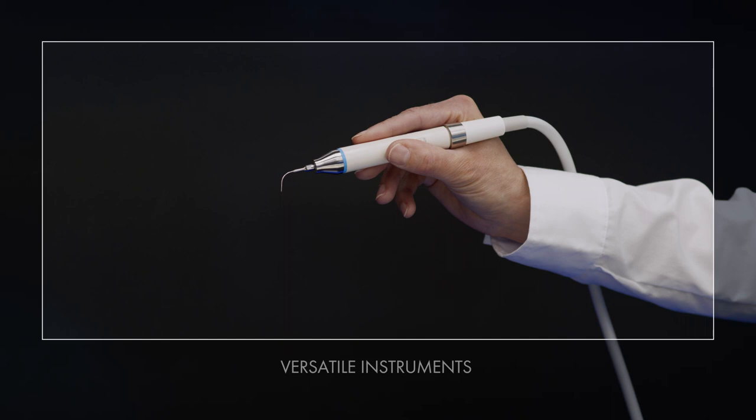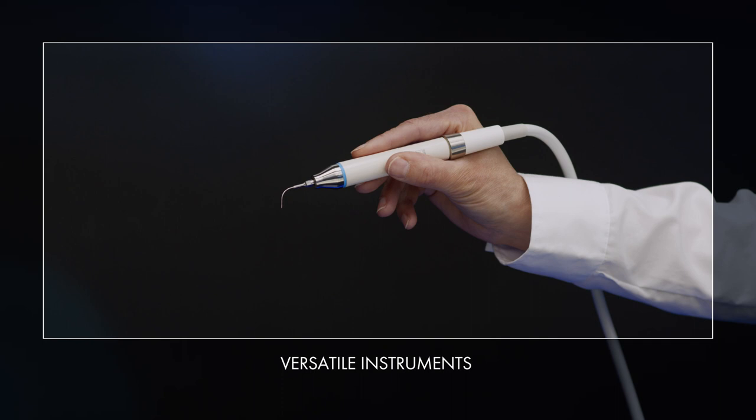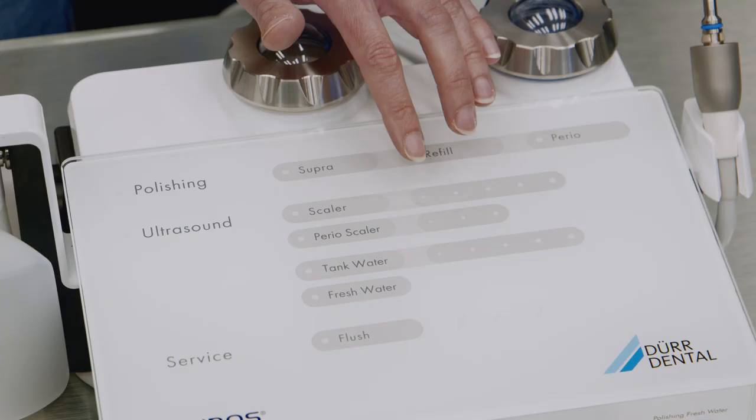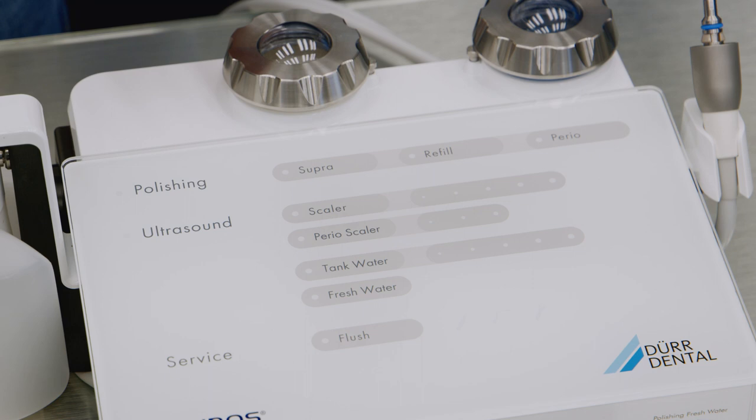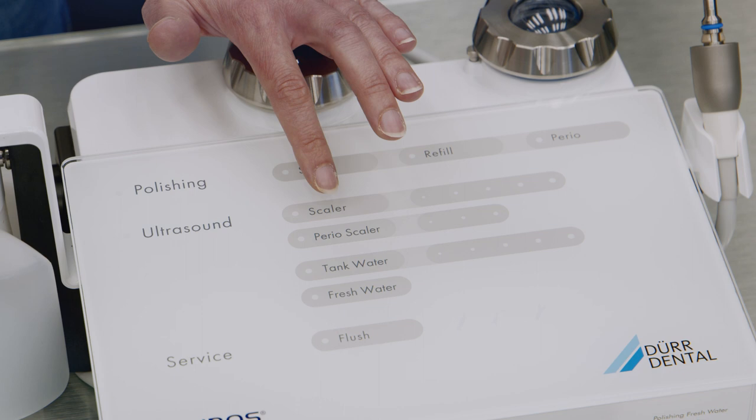An exceptionally wide range of instruments are available, which can be used for either supragingival or subgingival treatment, or for both applications. Depending on the instrument being used, the suitable power setting can be made on the device display itself. The scaler function is ideal for supragingival applications, while the perio scaler function is intended for subgingival treatments.